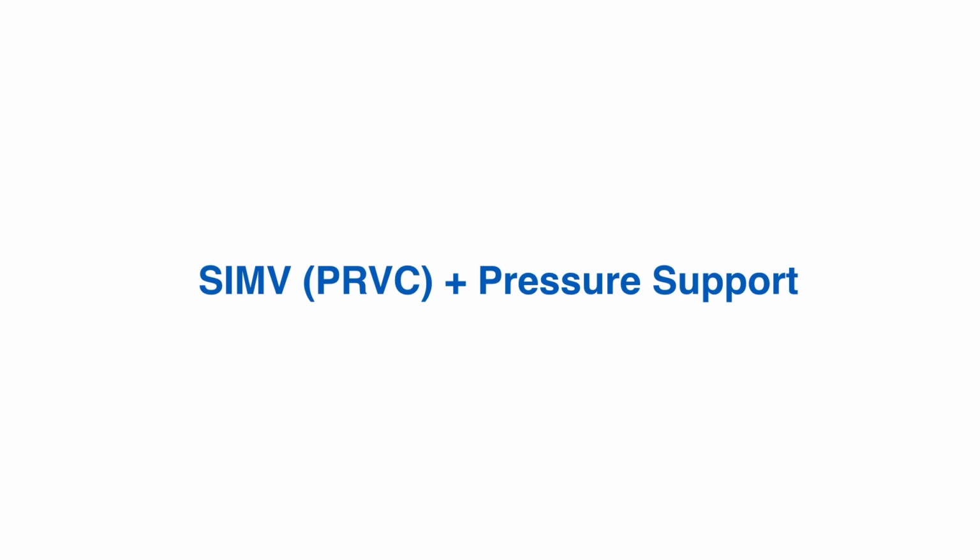So like with pressure control, you need to set tight alarm limits on the volumes the ventilator delivers. With a volume control mode, you need to set tight alarm limits on the pressures the ventilator delivers, because like I've said, the pressure will just adjust to deliver the same tidal volume. And what you can find is that the pressures will be very high and your patient's at risk of barotrauma, as the ventilator will insist on delivering the same tidal volume regardless of what pressure it needs to, if you haven't set the upper limit on pressure well.